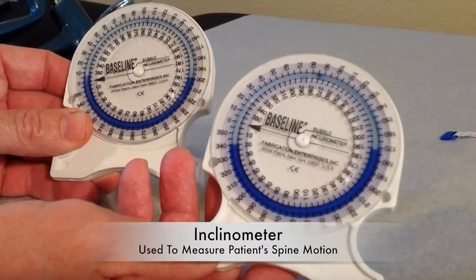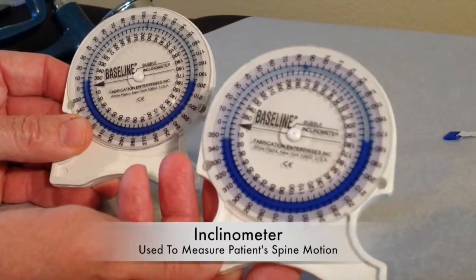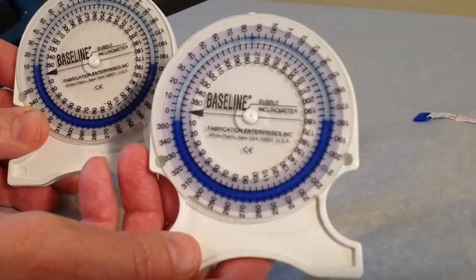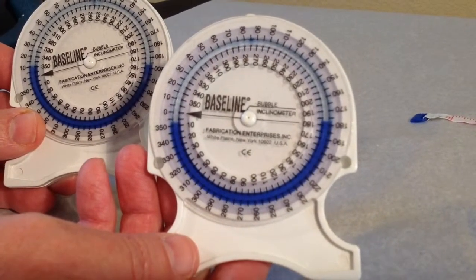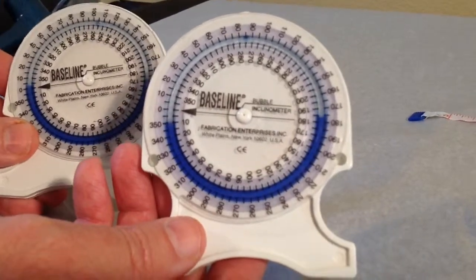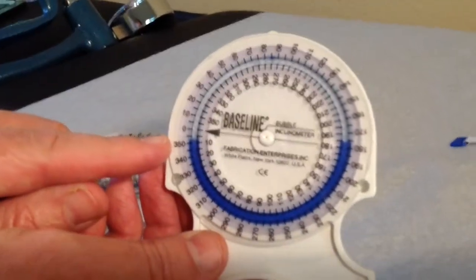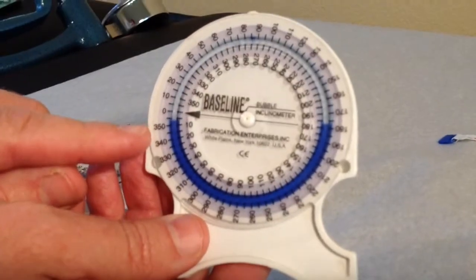These devices are called inclinometers. This device is a measuring device with 360 degrees published on the face. These particular inclinometers have a blue and white interface — an interface of oil and water.